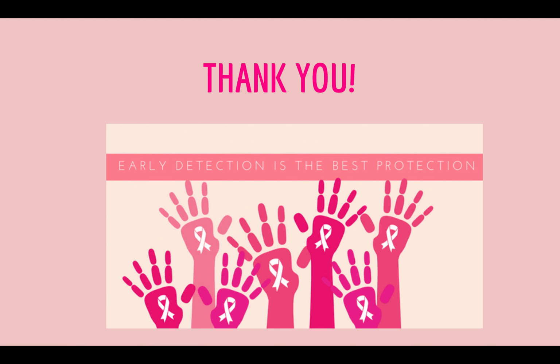So lastly, I would just like to say that a critical step in the battle against cancer is early diagnosis. It also exposes many treatment options if the cancer is diagnosed early, and it also increases the survival rate. And I think this can be achieved with the use of sophisticated machine learning technologies like deep learning models and AI. So I think we can explore a lot more in the field of AI and machine learning to enhance the process of cancer detection, be it any type of cancer. This project dealt with breast cancer detection. Thank you.